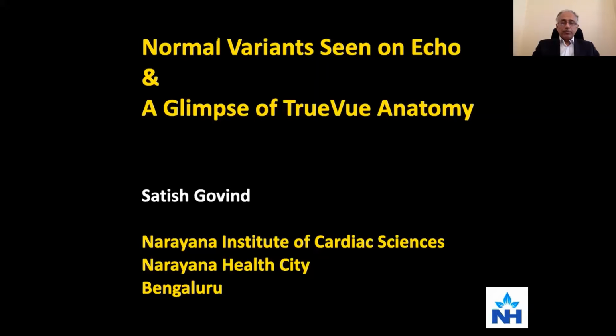and they give you problems now and then, some sort of heartburn. You are not sure whether it is normal or abnormal, whether to report or not report, or what exactly it is. And sometimes, even if you know, you're not sure what to do with it and whether you're really correct about it. So let's look at these normal variants.